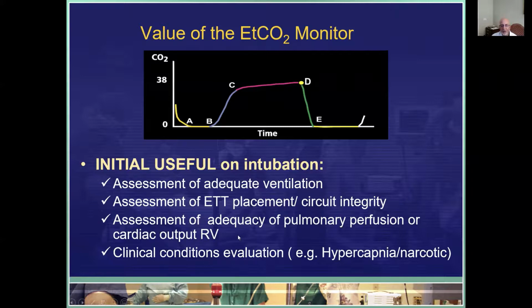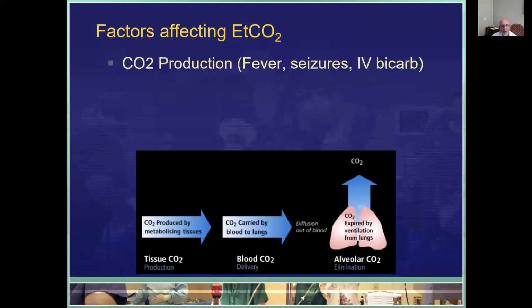It also allows you to ensure that there's adequacy of pulmonary perfusion or adequate cardiac output, which is very important, especially when the patient is in shock or the patient has a cardiac arrest. There are many clinical situations that end-tidal CO2 is of benefit, and I will review such clinical conditions in the second part of the series of talks on capnography.